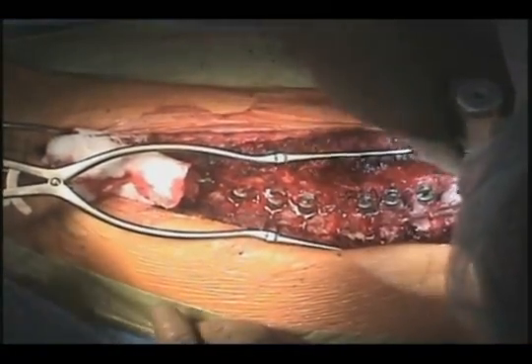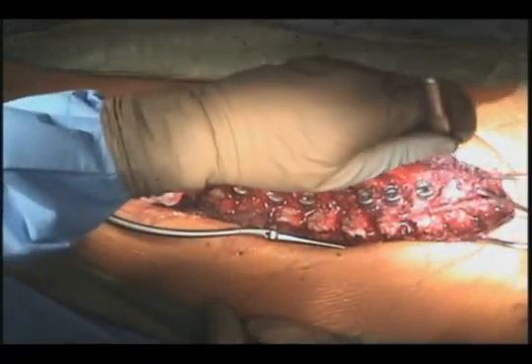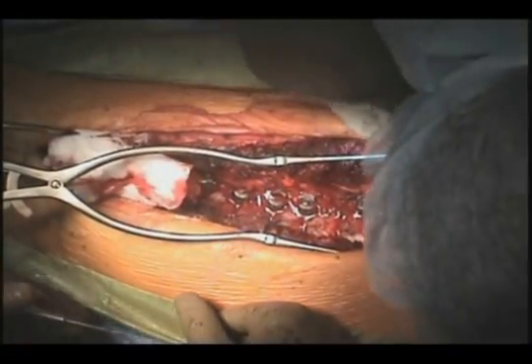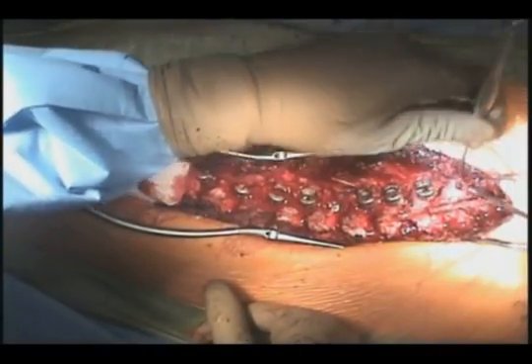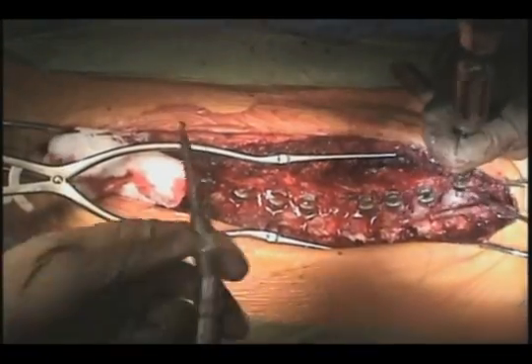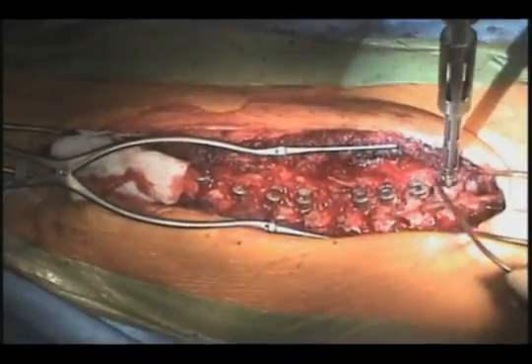It is particularly sensitive to blood pressure changes, but has been an important modality in our treatment of scoliosis patients. There can be false positives and false negatives in the use of somatosensory evoked potentials, as these monitor the posterior sensory tracts, and the transcranial motor potentials allow us to monitor the anterior motor tracts of the spinal cord. And again, it is a very sensitive modality, giving us instantaneous feedback within seconds if there were to be an event.